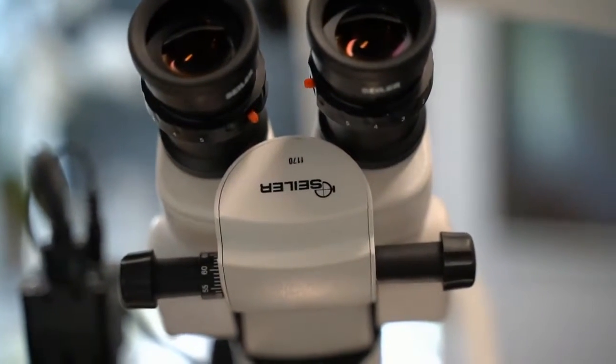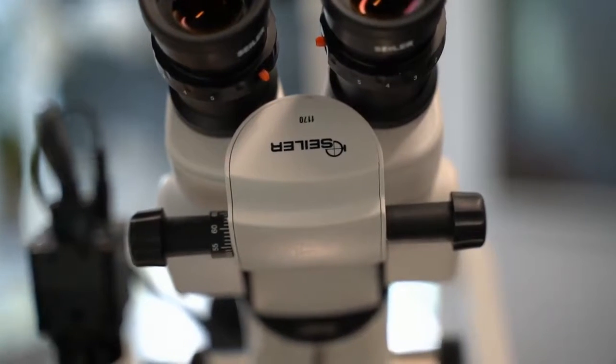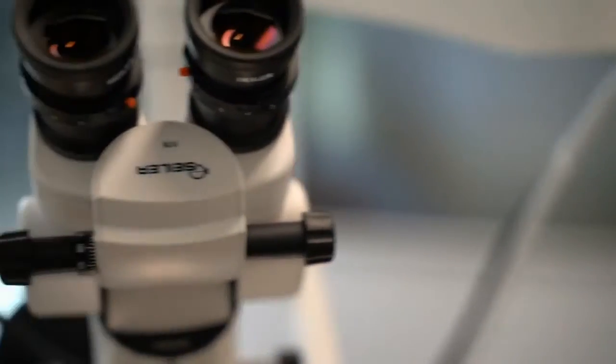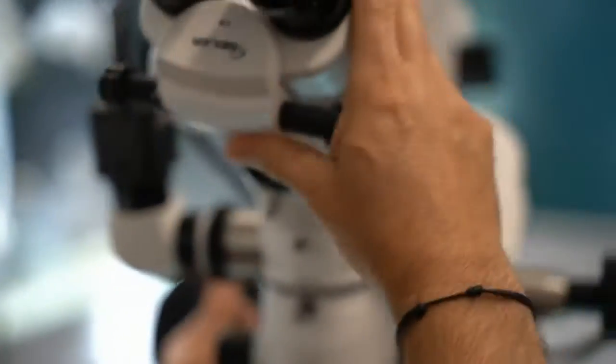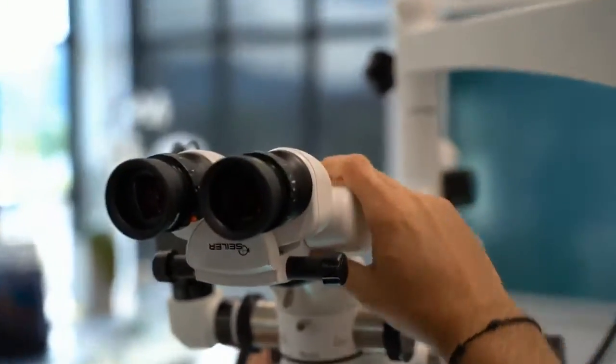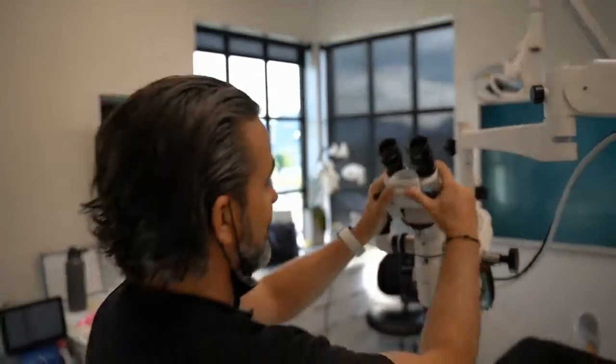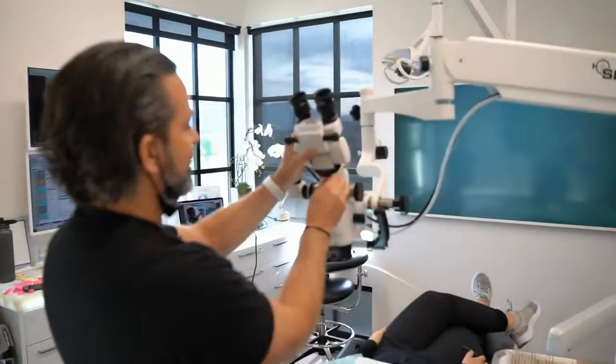The next question was about your eyepieces being upside down. Yeah, so that's another thing that I've done. That is upside down on purpose. And I guess, like I said, they get personalities, but we're dentists and we'll do what we want, right? That's not how they'll tell you to do it. What they'll tell you to do is, and I've got all these little adapters on it.